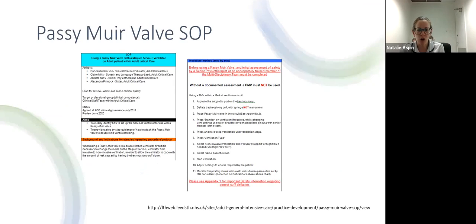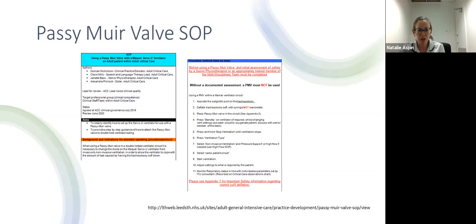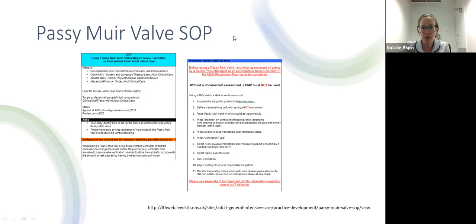There is a Passy Muir valve SOP with a link at the bottom of the slide if you want to look at it more closely, and we're now going to demonstrate how to insert the Passy Muir valve.